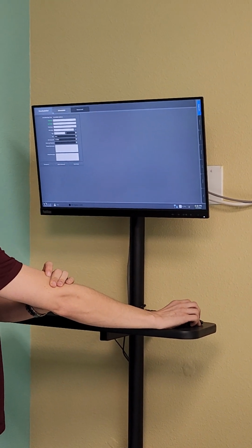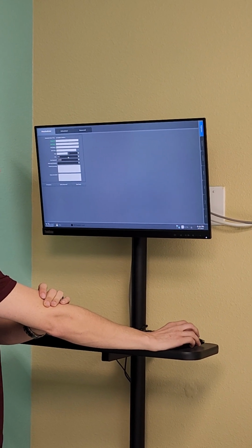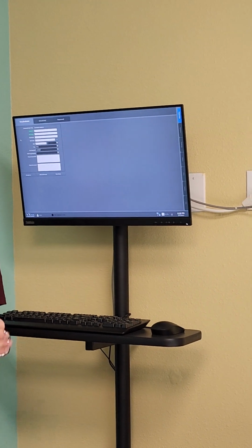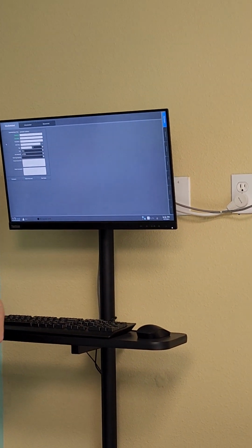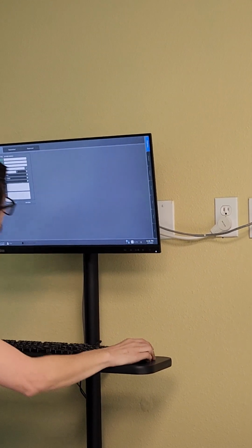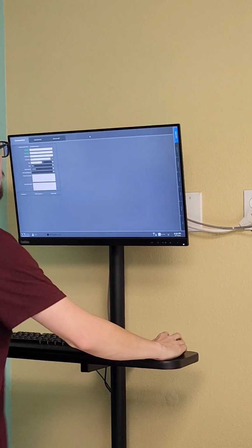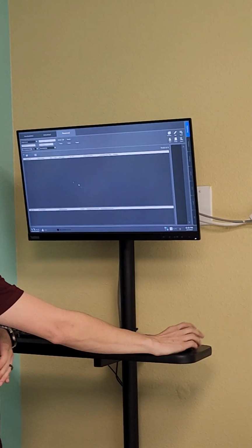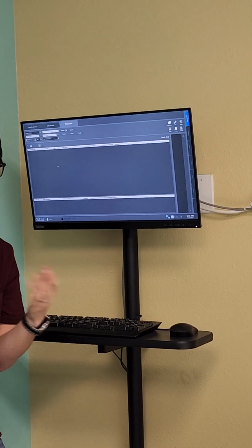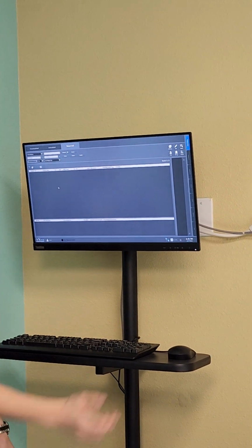I'm just going back to let y'all know the difference between unscheduled, scheduled, and reserved. If you know you have a few different patients for the day, you can add them all now, like in the morning, to reserved. If you look right here, this says add to reserved, and then that will put it over into this reserved tab, so you can go and select your patient. And you don't have to type in the patient information every single time.